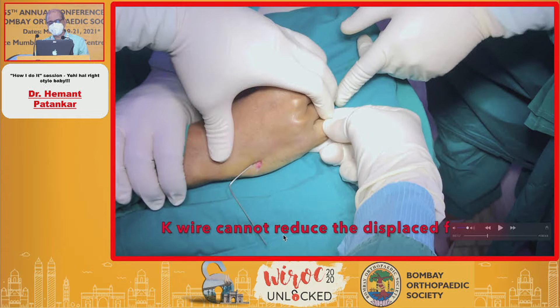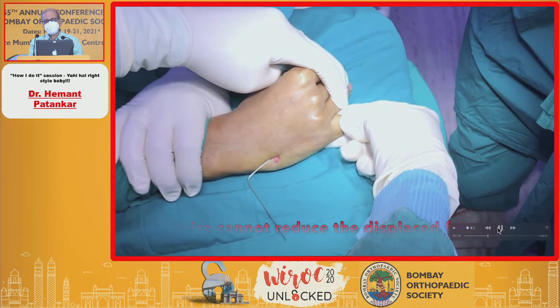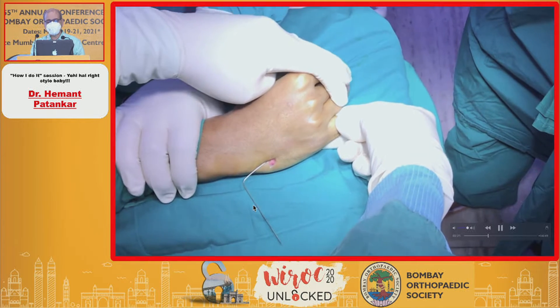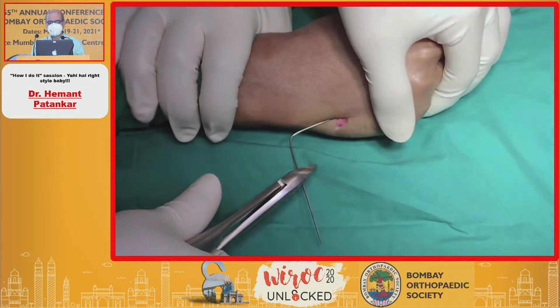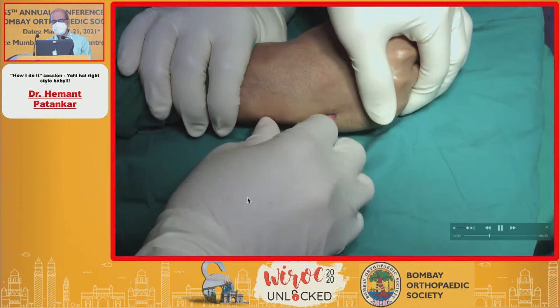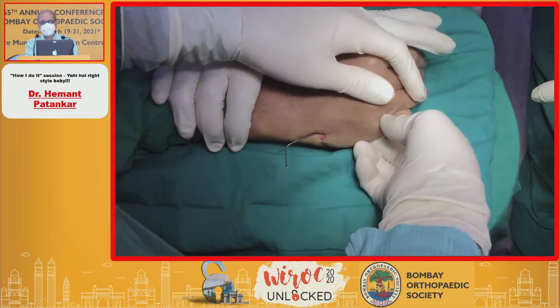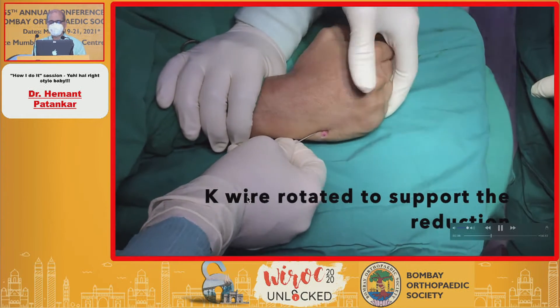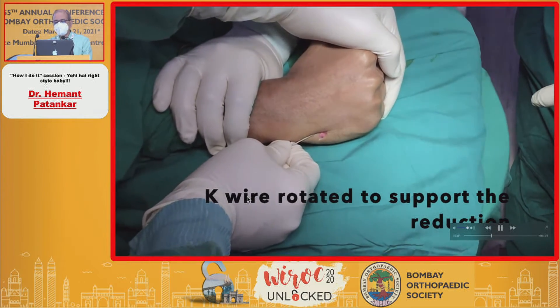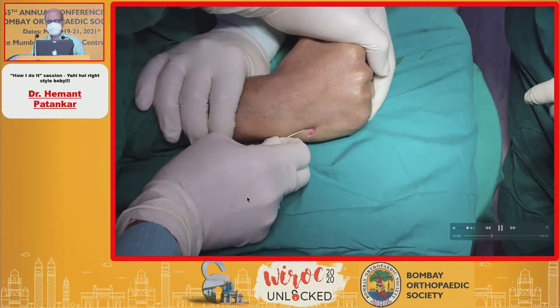Three inches of the K-wire is outside and three inches inside. Remember the hand is on the table in a PA position. You cannot turn the K-wire unless you cut it. Once you reduce the fracture, you will have to cut the K-wire — otherwise it cannot rotate with your hand; it cannot rotate with the T-handle either. So this K-wire is cut and then you keep turning it and pushing it, taking occasional C-arm shots, rotating the K-wire to support the reduction.